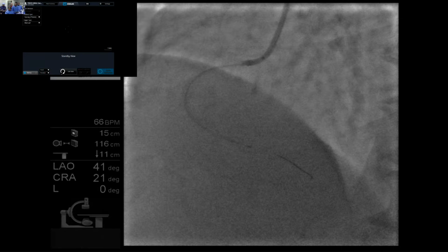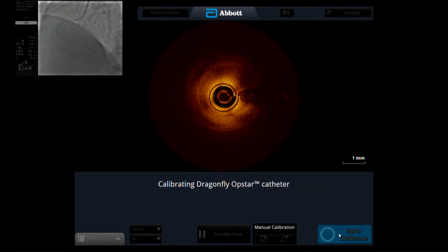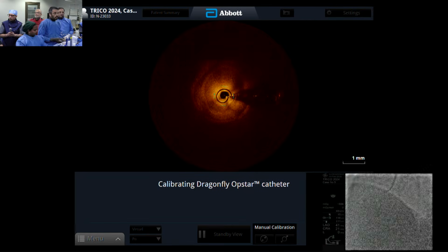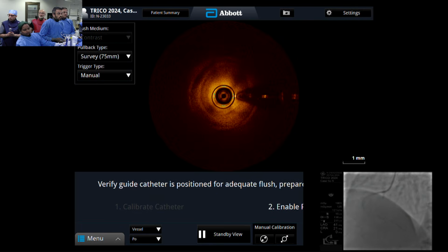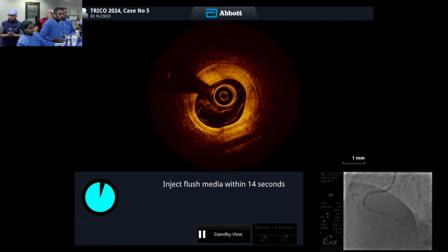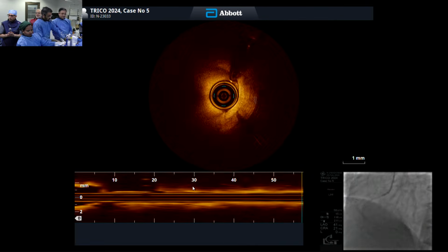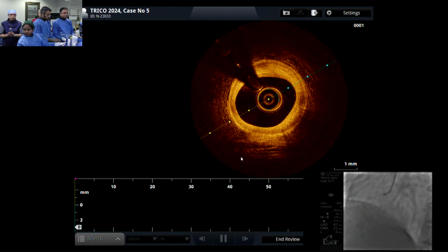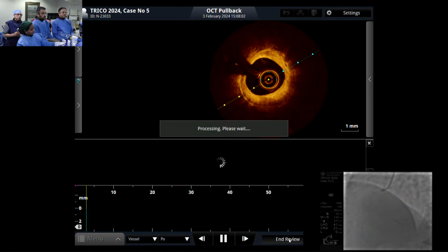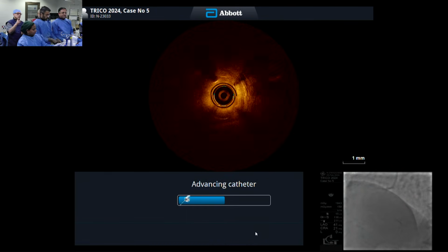Fluoro. Live view. Pressure okay? Ready? Go. Now inject. Oh no, I think we'll have to do it again. It's stuck there, I think in the small branch. It did move, but it moved afterwards. So here we had to give a slow and extremely delayed injection.